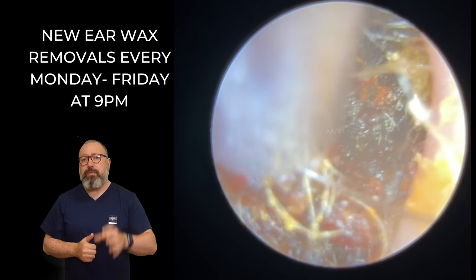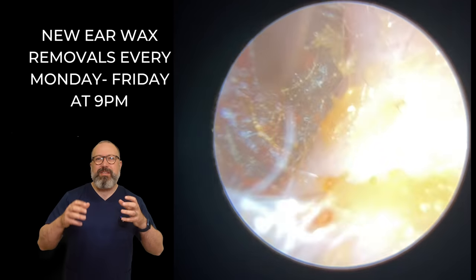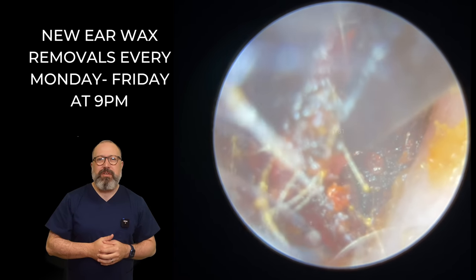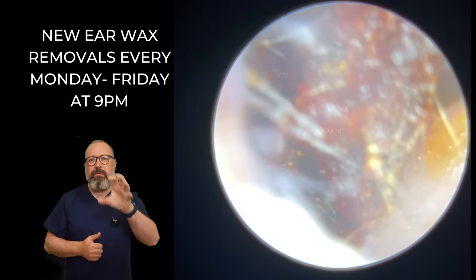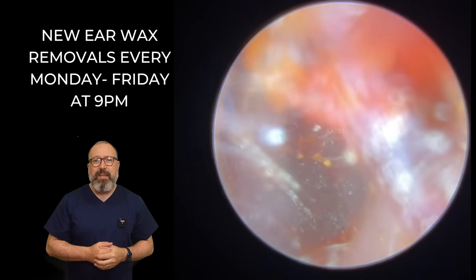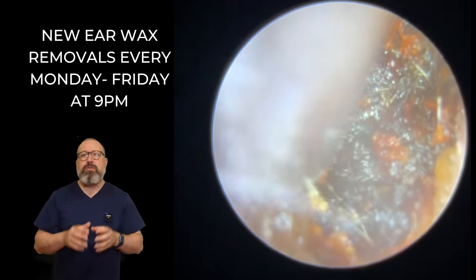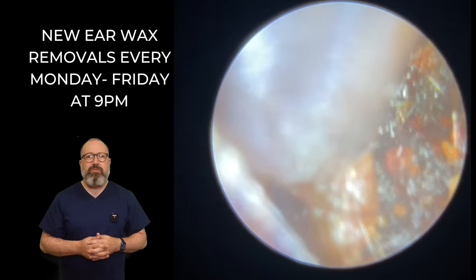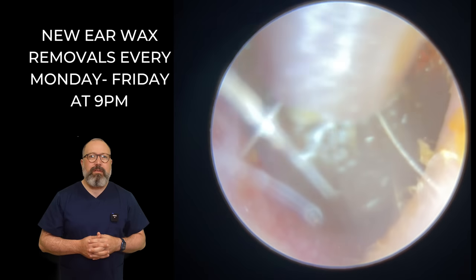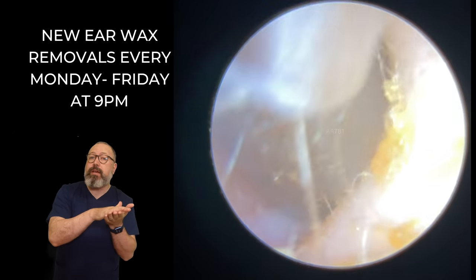And then that wedges it enough that we can get the Jobson horn behind it to pull it through. But you can see it's quite a hard lump, this one. It is coming out, but there's a few hairs embedded in there so you get this almost slight little bit of looseness to the plug. So I just want to get rid of this front section because this is stopping me from getting a good grip on the plug beyond it — the main meaty chunk of the plug. So this is coming away nicely. A little bit of skin in there as well. Out that comes. Now we can get onto that flatter surface beyond. Let's try and lift this up and work it out of the canal. There we go. You can see that smoother underbelly of the wax — that's where it's been sitting and resting against the canal wall.